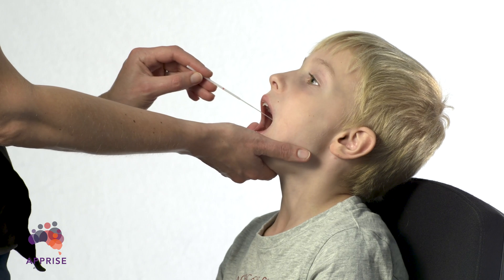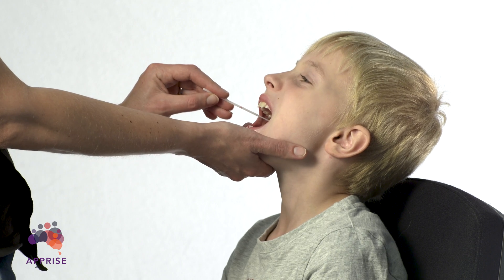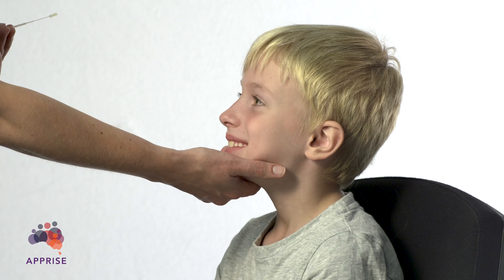Insert the swab to the back of your child's throat and in a sweeping motion, swab the back of their throat and tonsils. Avoid touching their tongue with the swab tip.